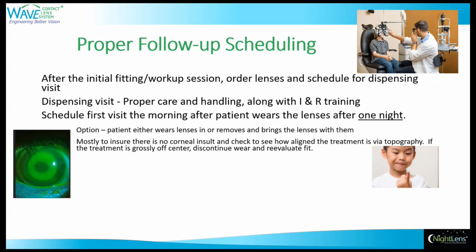Now, with the lenses on, the patient should see perfectly. So if it's a patient that is driving, they can wear the lenses in, do your evaluation, take the lenses out. But they're not the most comfortable, so they'll be very happy when you remove them in the morning, if they have worn them in.